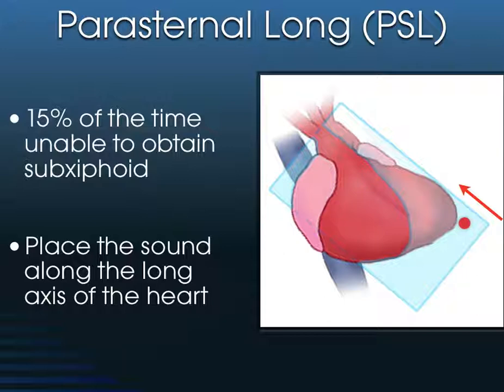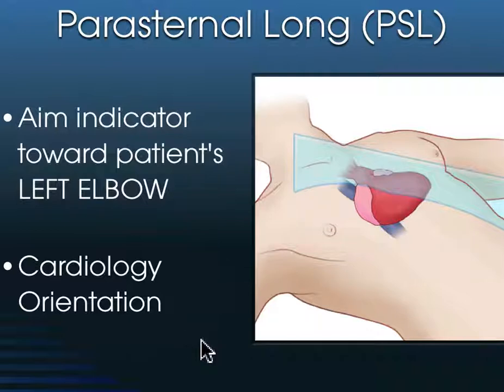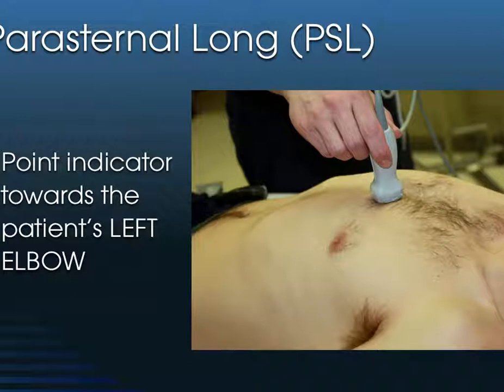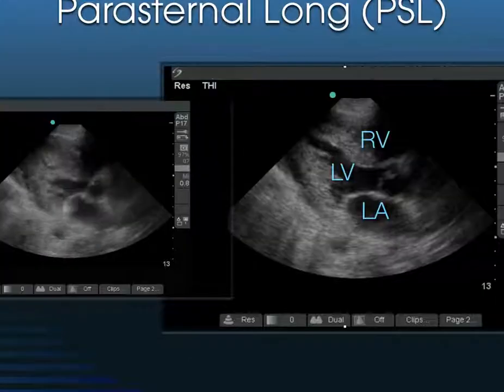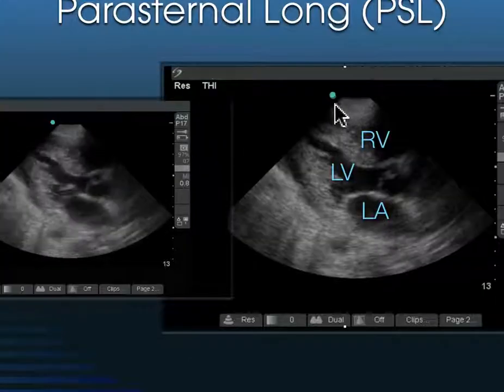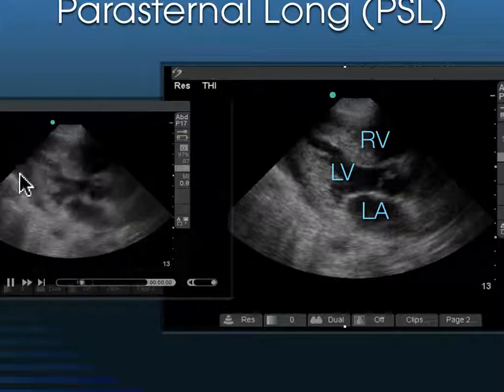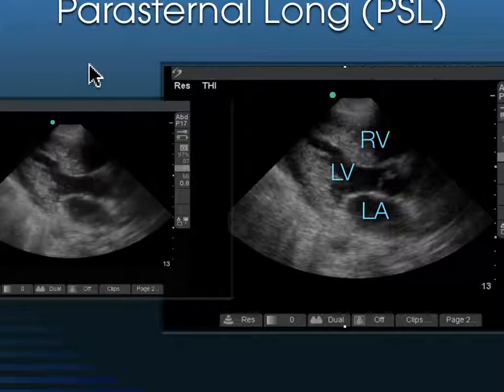As its name suggests, parasternal means next to the sternum, in the long axis of the heart. We use the cardiology orientation, where we take the indicator and aim it so that the apex is towards the indicator on the screen. Here's our sternum right here — we're just to the side of it. That's the indicator, that little nipple with the groove next to it. We aim that indicator towards the patient's left. Therefore, the apex of the heart will be on the side of the screen where the indicator is.